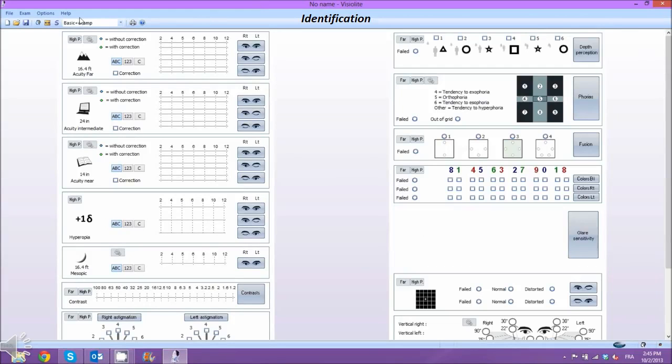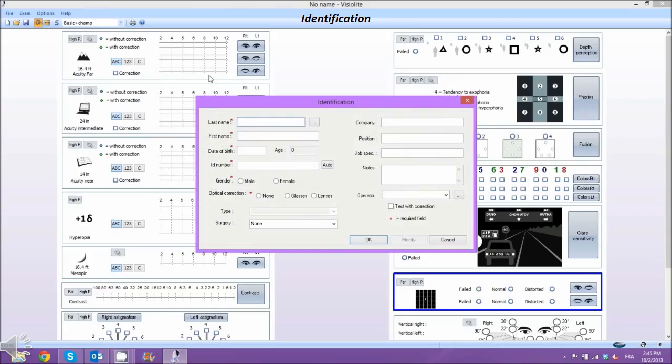For identification, run the VisuLight software as shown. Create a new file, then enter all the required information. Click on Validate. You are now ready to perform a test.